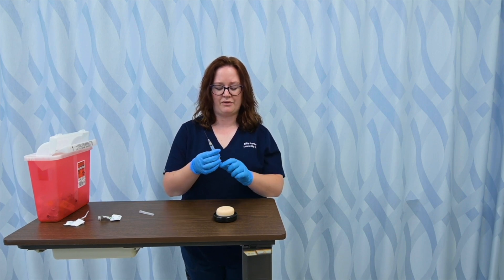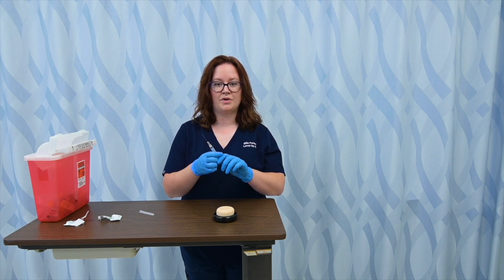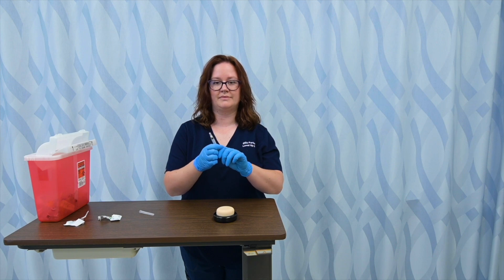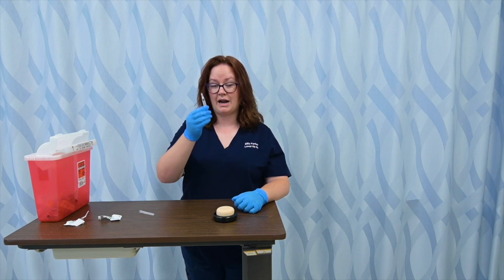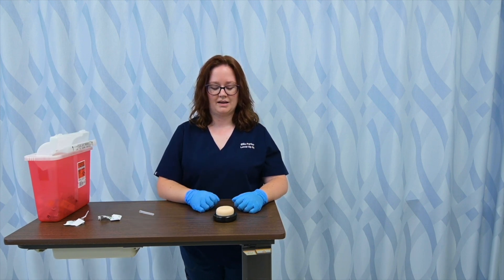This particular needle has a safety mechanism. If you're using safety needles, you want to immediately employ that — as you can see, the needle retracted back into the syringe. I would still need to immediately place that into a sharps box. And that's how you do intramuscular injections.